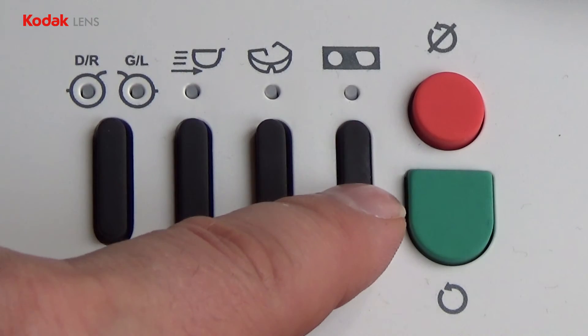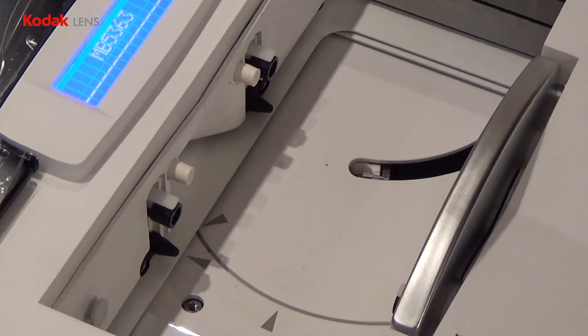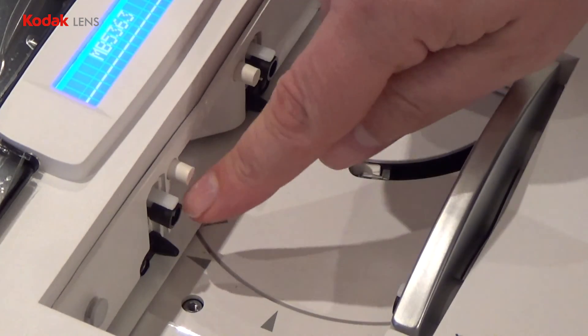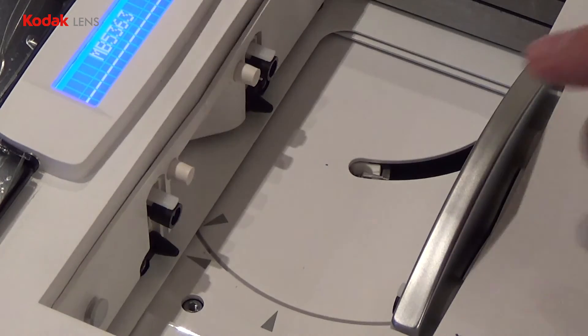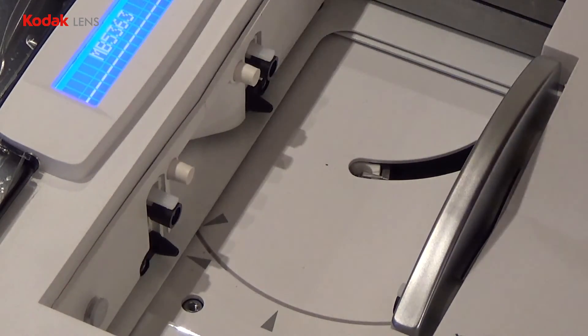Press the calibration button on the tracer and check the number matches that on the screen. Insert the gauge so it sits on the bottom black pegs, and use the silver bar to close the jaws.